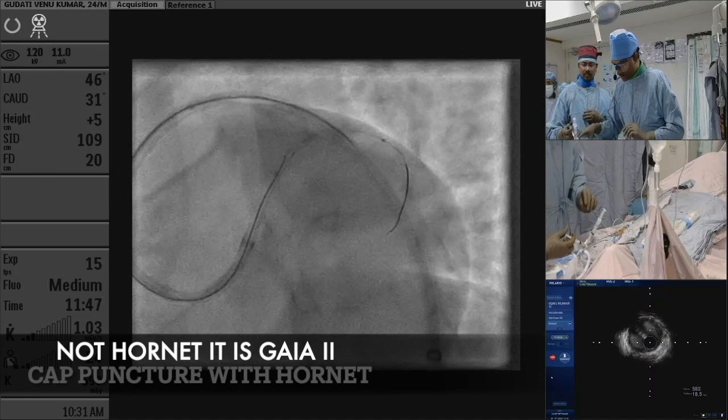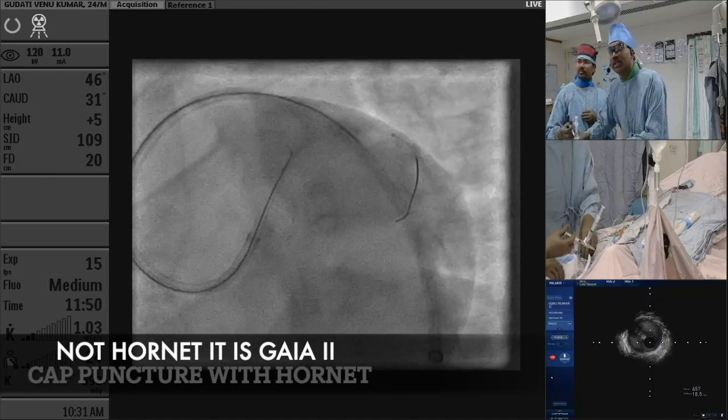So it's in the direction, right? So look, I'll just check.